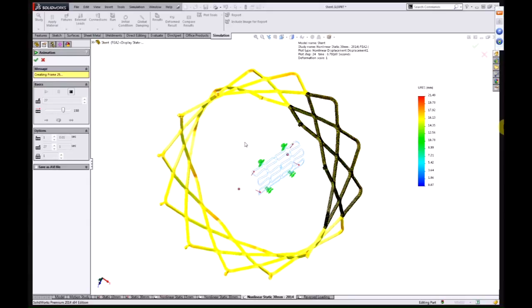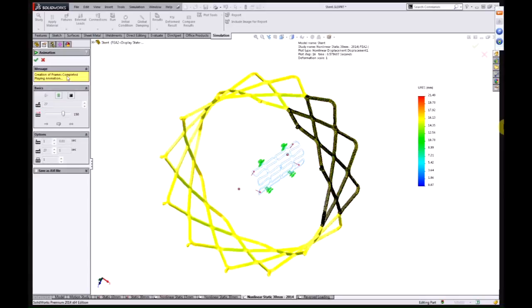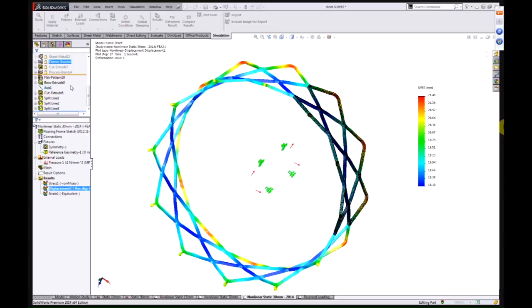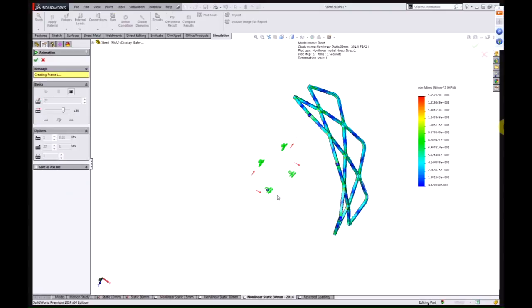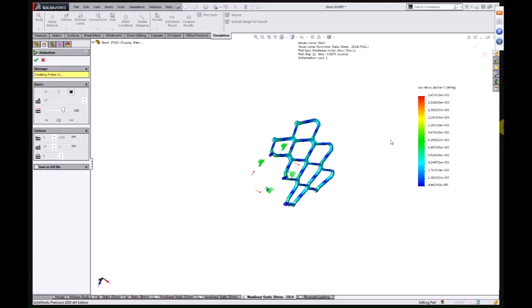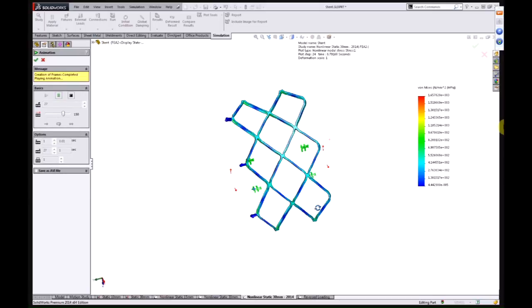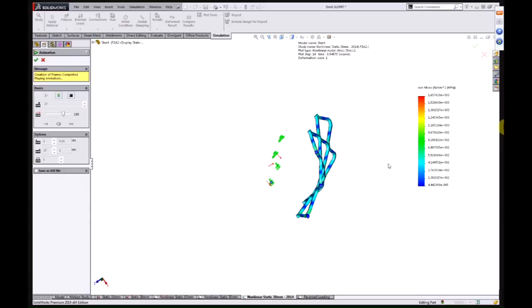In this case, we would have significantly exceeded any failure stresses of this material, and so we'd predict some sort of failure long before it got to this size. But we're talking hundreds of percent of strain that's available when we distort this outwards. See how the shape of it is changing as it's being asked to go out there. So pretty extreme displacement.